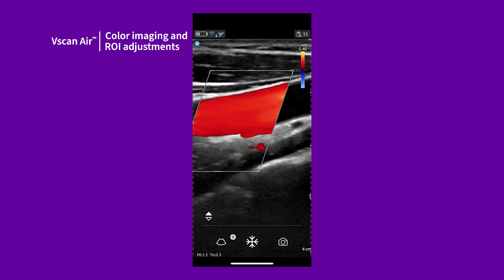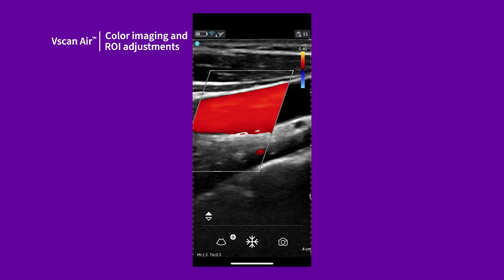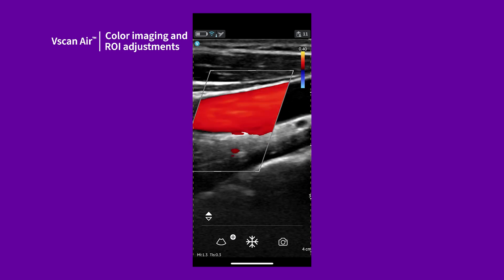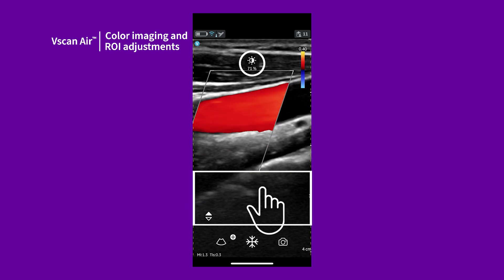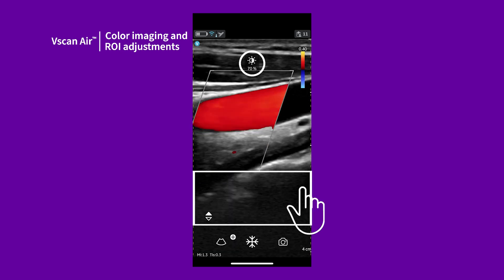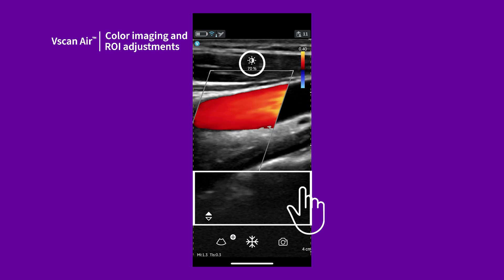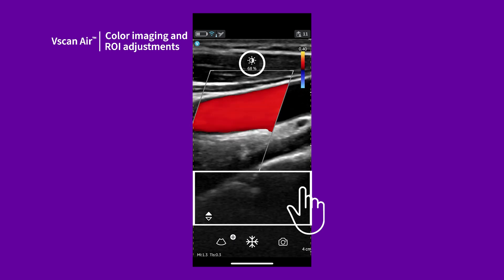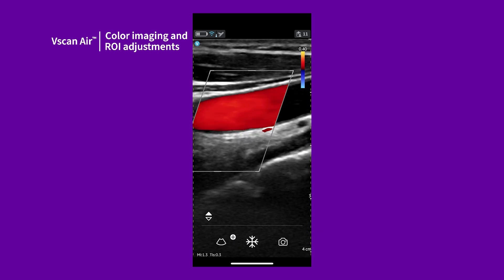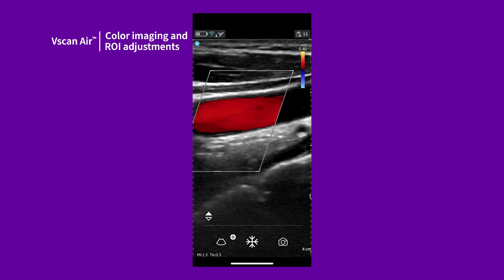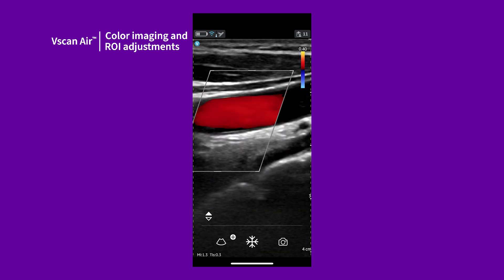Color gain can be adjusted in the same way as black and white gain by sliding a finger horizontally across the image, taking care not to swipe across the color ROI when scanning in color flow mode.